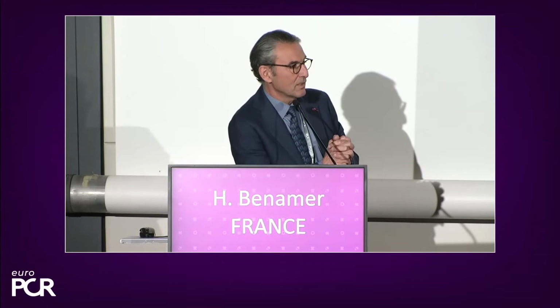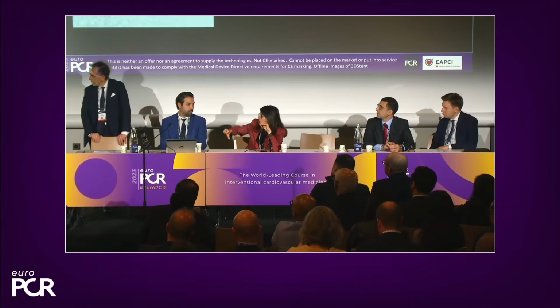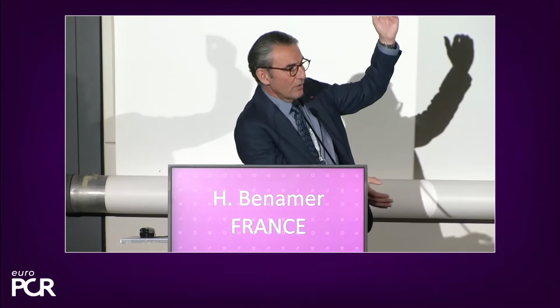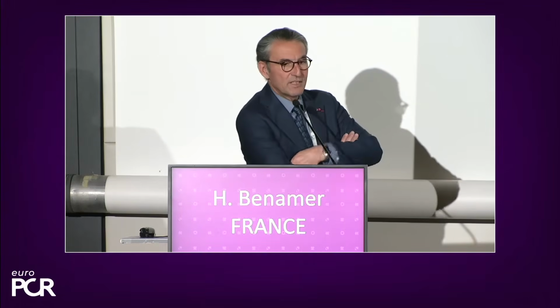Okay, so for example, in a situation like this where you have a long segment that has been stented, you would evaluate it in parts. Yeah, you can do it with the balloon in different parts, for example. This can be done. But if you want to study all the area, you must put a long balloon, including all the stent that you have put. Salvatore.